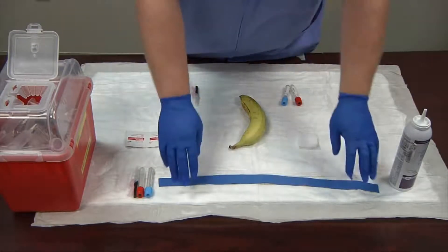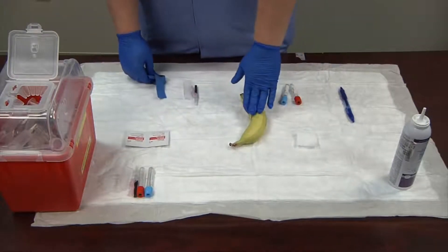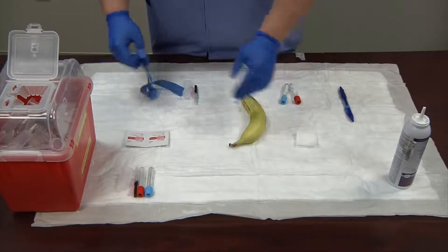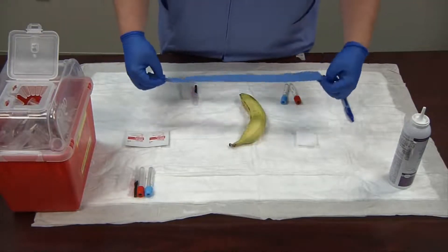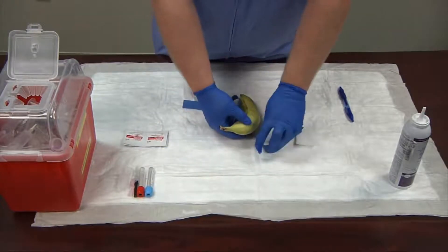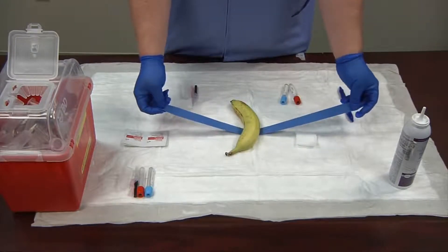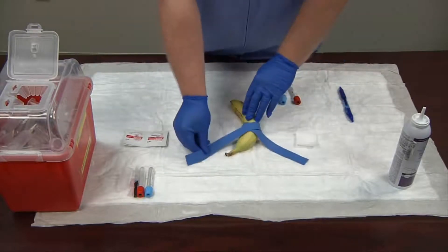Now I have my gloves on. I'm going to take my tourniquet. This is my patient, Mr. Banana — I've already ID'd him and compared him to the requisition that the doctor issued. The ID matches up and I have informed consent from the patient, so let's begin. I'm going to wrap the tourniquet around Mr. Banana. We won't be able to tie it all the way since the tourniquet would be too rough on the banana, so we'll simulate this by just laying the tourniquet over.